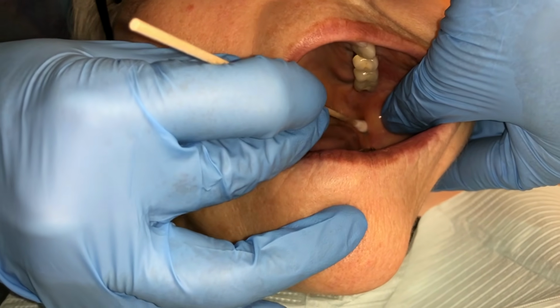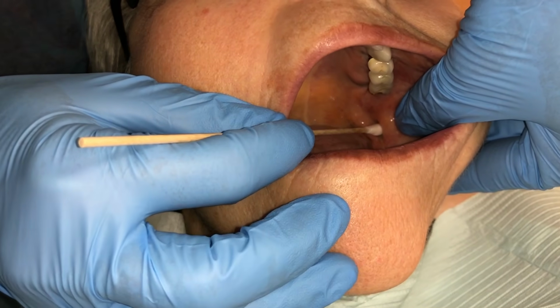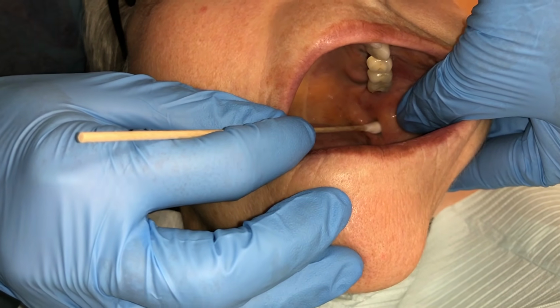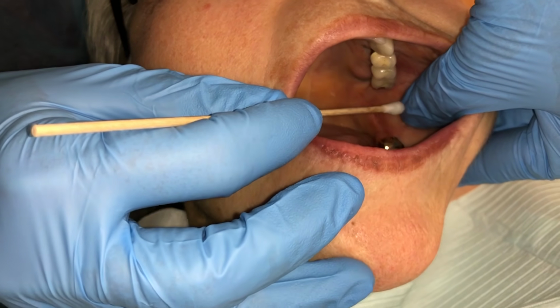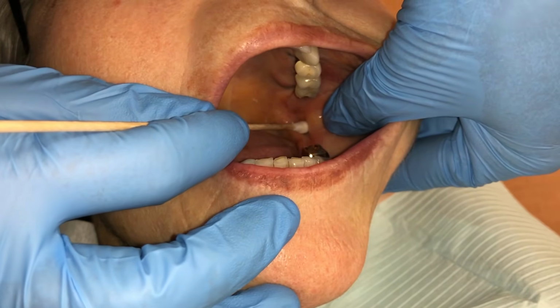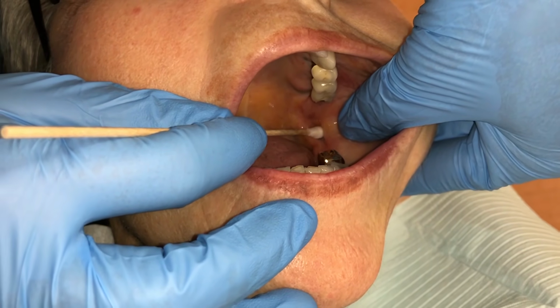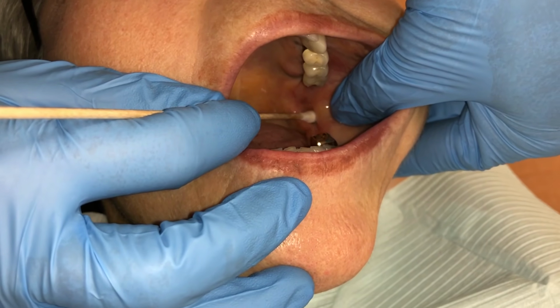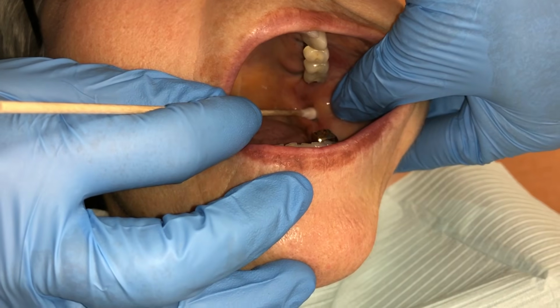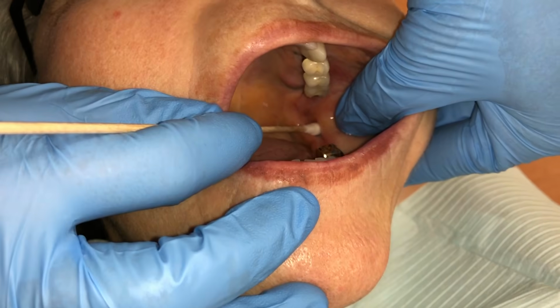Note in the video, the clinician is identifying the deepest portion, rocking the Q-tip over the contralateral premolars to view both the angulation and penetration. The Q-tip and the thumb are lined up so the middle of the thumbnail is even with the Q-tip. This assists the clinician during penetration to re-identify the insertion location.